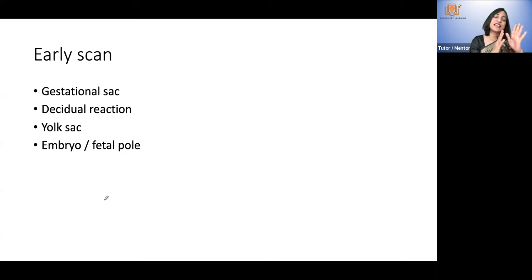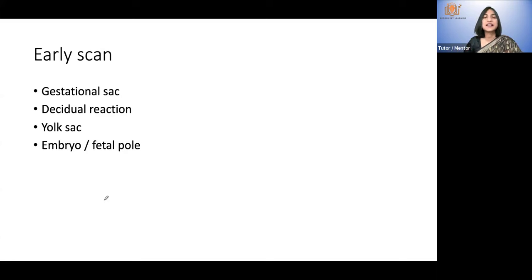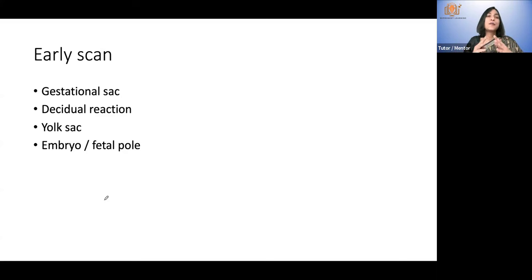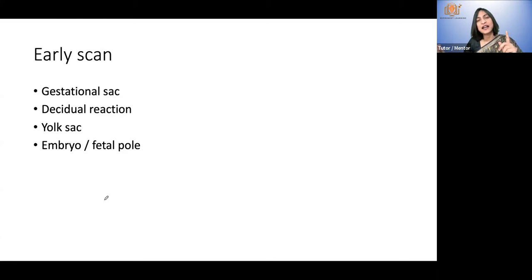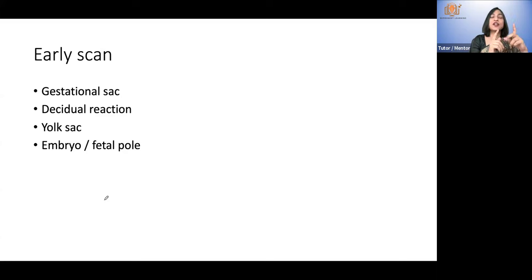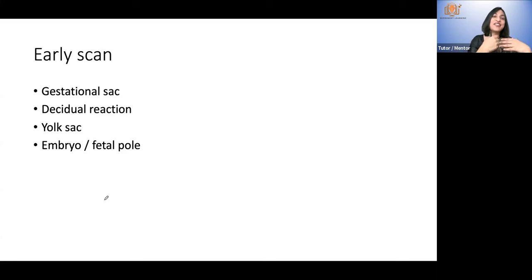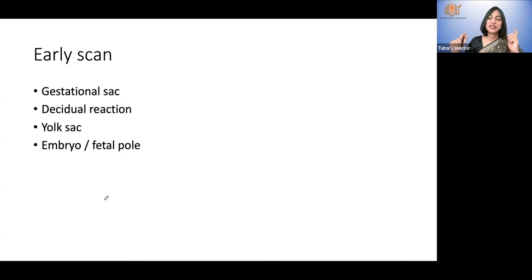When you see the fetal pole, generally in a healthy pregnancy you will see cardiac activity right at the time you see a fetal pole of two millimeters. But in some pregnancies you will see it later. Until you see cardiac activity in the embryo, it is called a pregnancy of unknown viability. When it is called a miscarriage is a subject of the next class.